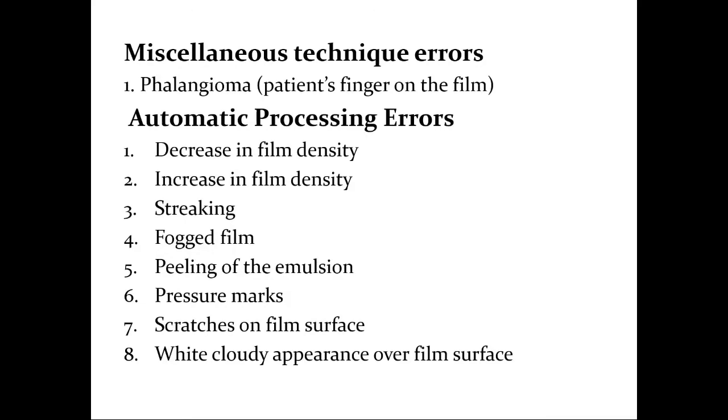And in the miscellaneous technique errors, you have the phalangioma. Phalangioma is nothing other than the patient's finger being placed between the X-ray beam that is being exposed and the film. It is between these two areas that the fingers are placed. That is when you notice this kind of error, that is phalangioma.